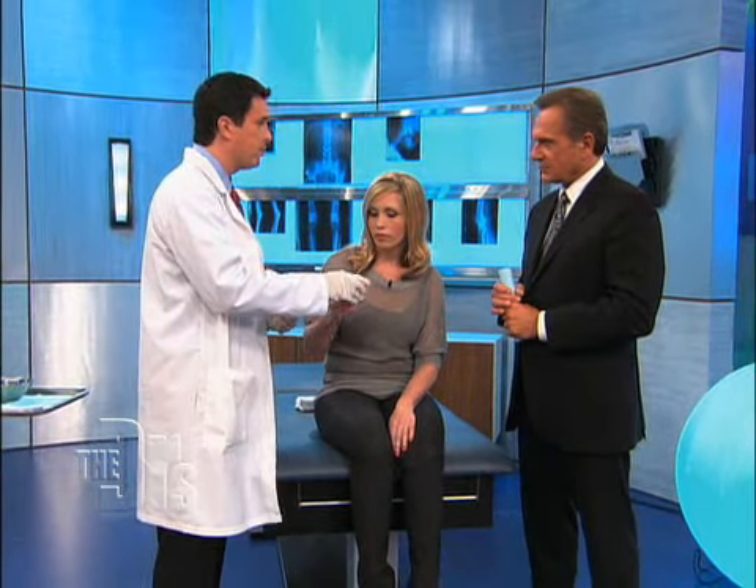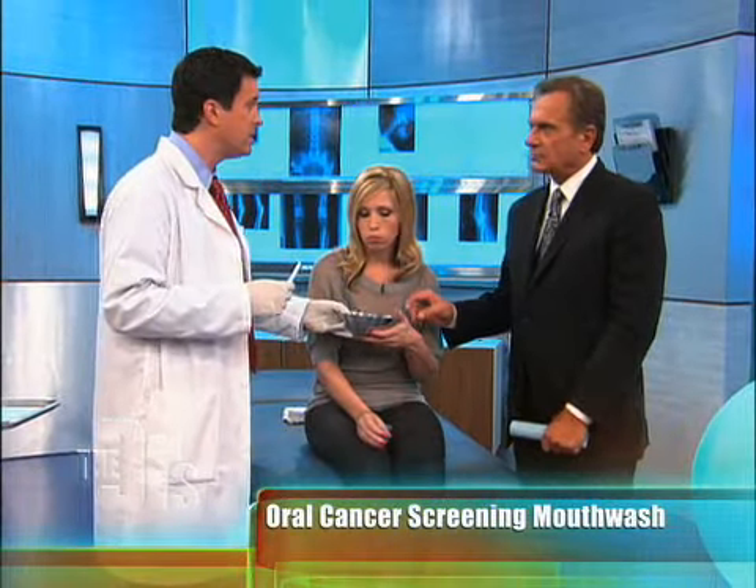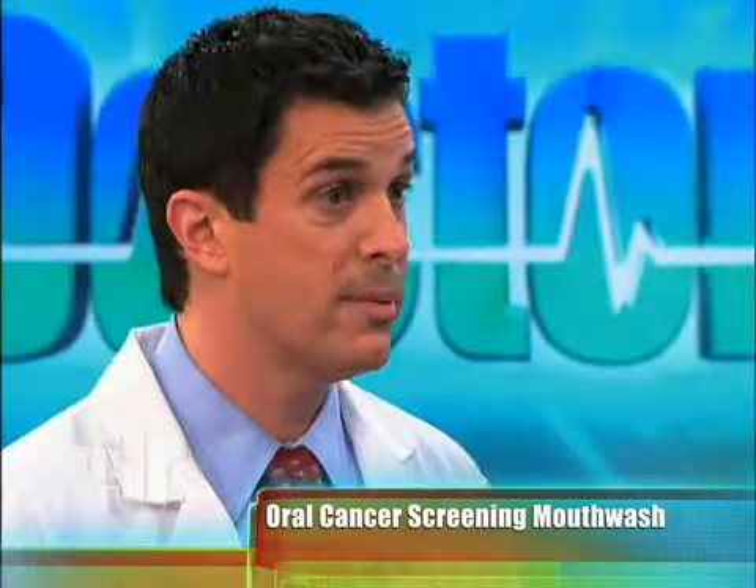So tell us about the Visalite. Well, how this works is very simple. Teresa, would you take that and swish that around for 30 seconds. This is basically a vinegar-based product. What the vinegar does, it dries up the mouth. I'm going to take this light that I just activated, and we're going to put this in the mouth, and we're going to actually take a look, and we're going to see if there's a lesion that literally lights up. So what color would you be looking for something that's abnormal? I'd be looking for something that's white. It would literally light up like a Christmas tree.